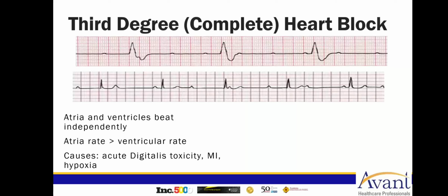With a slow ventricular response, such as this first example, the cardiac output is severely compromised and patients are likely very symptomatic. All right. So what are we going to do? Now, you notice I have two different strips. They're both heart blocks. I mean, they're both complete heart blocks. The difference is this is narrow and this is wide. Remember way back in the beginning, I talked about that camera again?